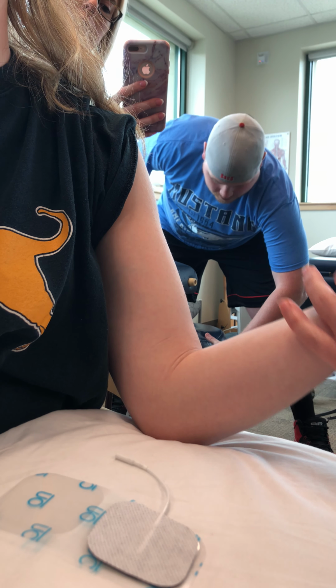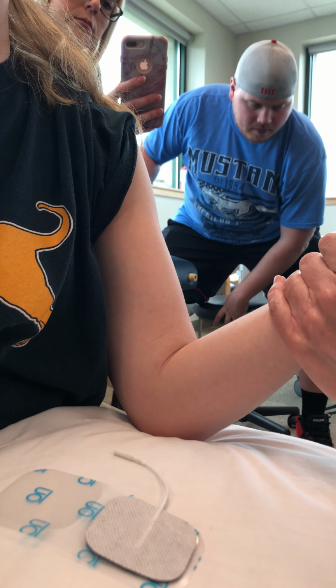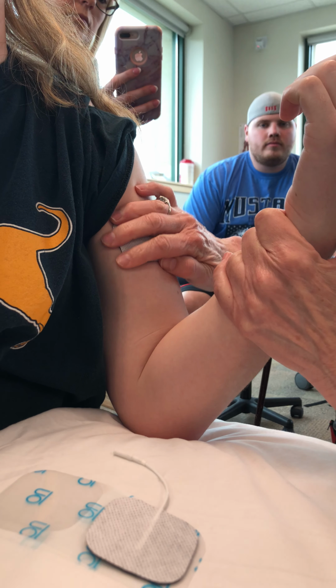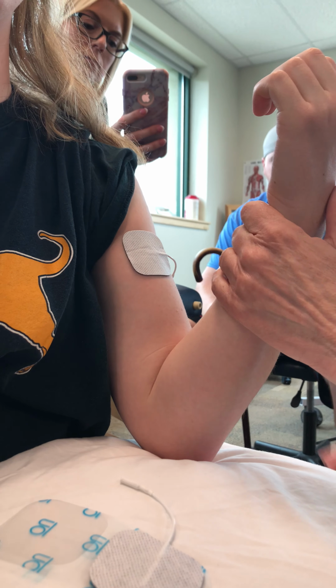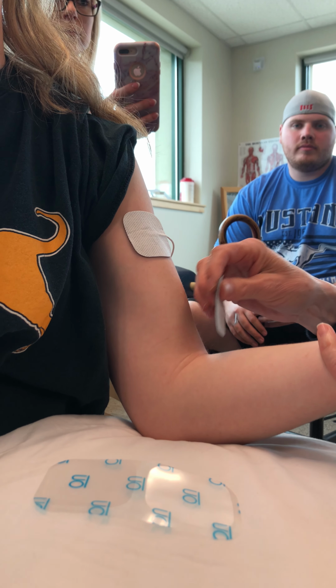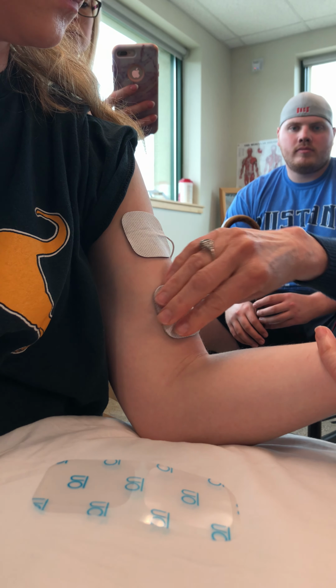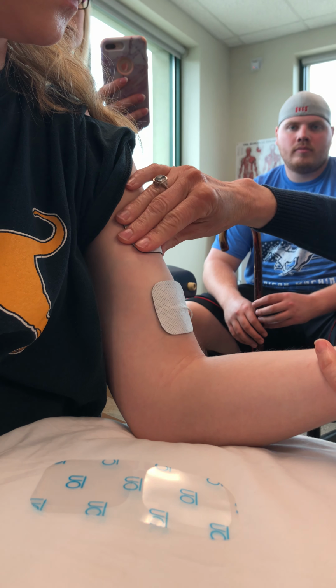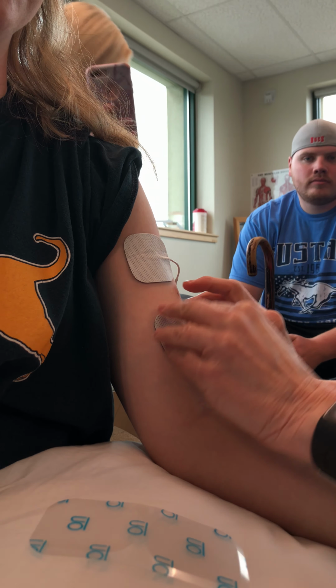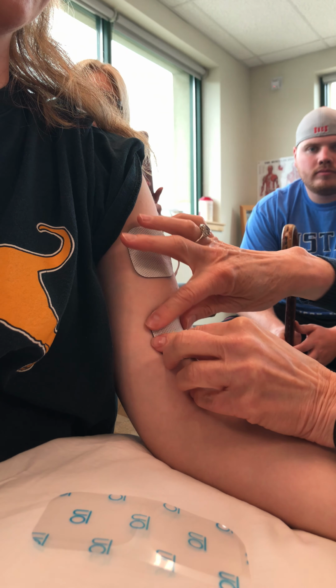Can you try touching your hand to your shoulder? You want to find the muscle belly as best as you can, because the muscle belly is going to be better, has more water than the tendon. Now with the biceps, are you trying to distinguish both heads, or it doesn't matter? Just the muscle belly. I usually want the muscle belly, not really where the origin and insertion are.